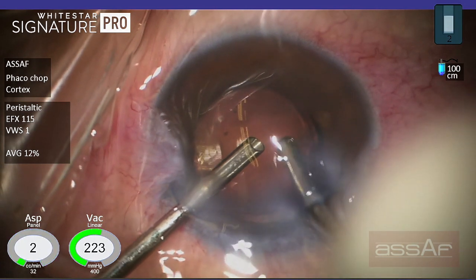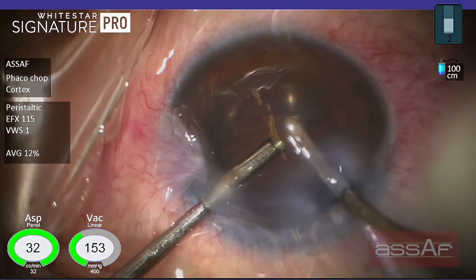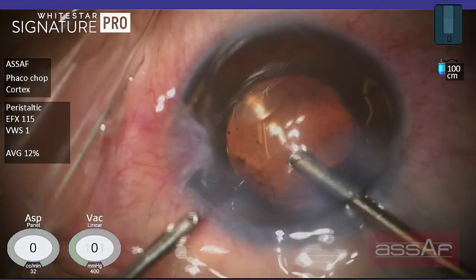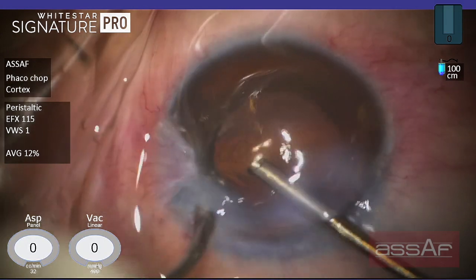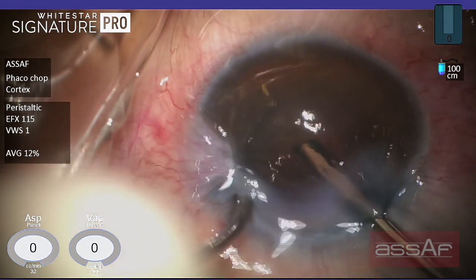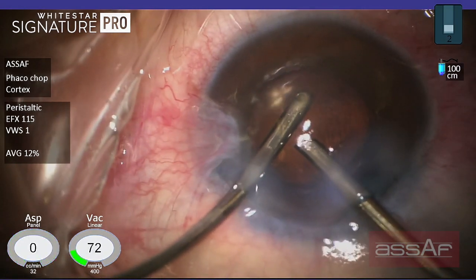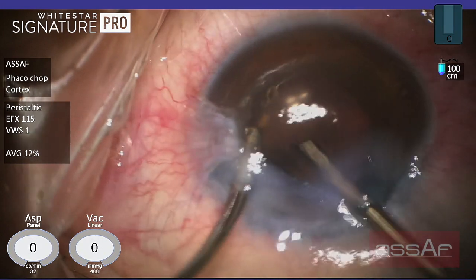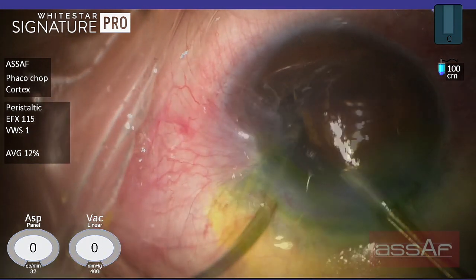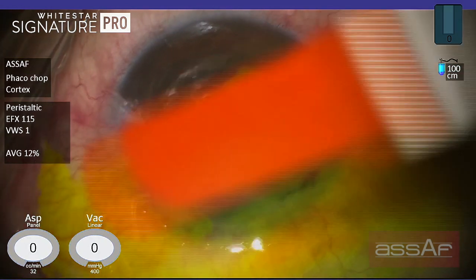Irrigation-aspiration of the OVD from above the IOL optic. If there are some cortical fibers left, we can remove them easily. Now trying to get access behind the IOL optic to clear the OVD behind the IOL, because if left inside the lens capsule it might induce post-operative pressure spikes, which is not good for this compromised cornea.